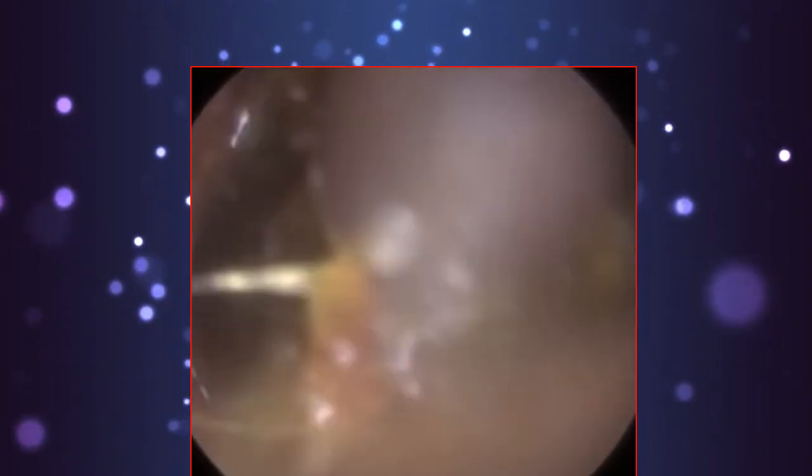If you think about the cotton bud, it's probably the same diameter as the suction tip that I'm using, and the suction tip just about fits in this ear. Therefore, a cotton bud is just going to push the wax in one direction, that's further in the ear. So I just put some sodium bicarbonate drops in there to see if that helps.